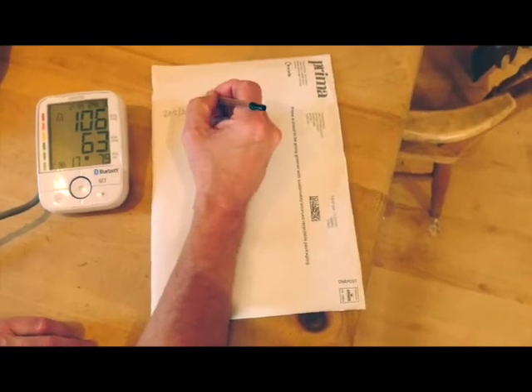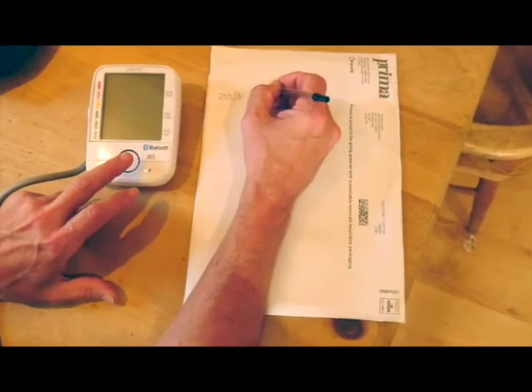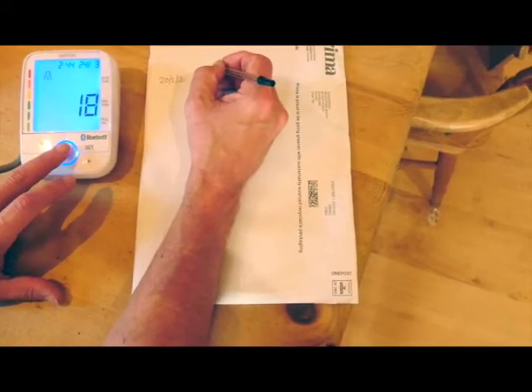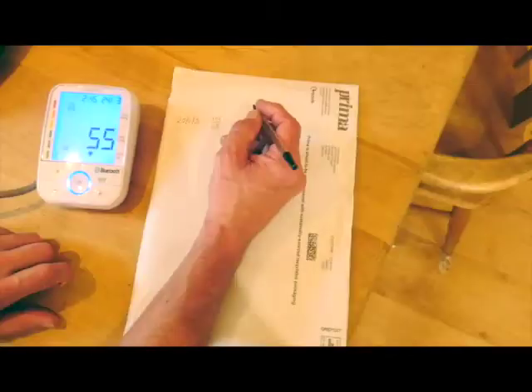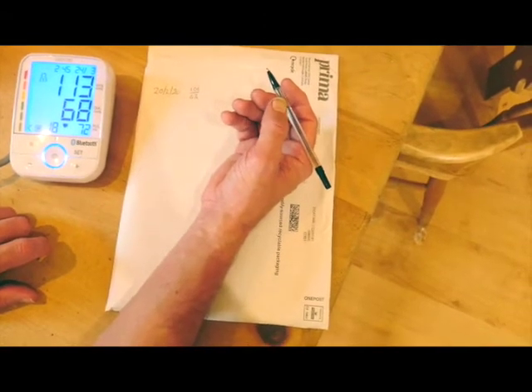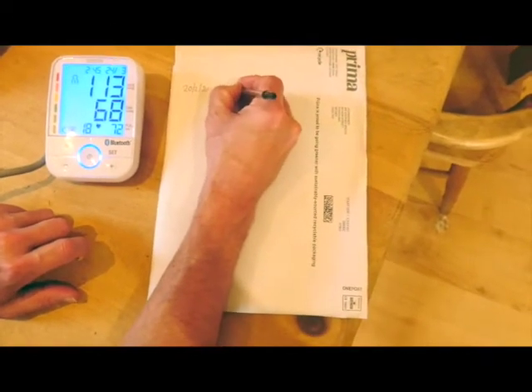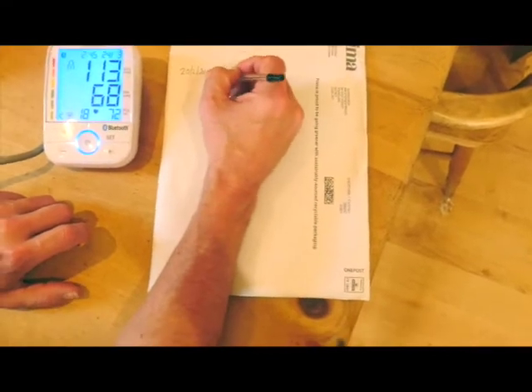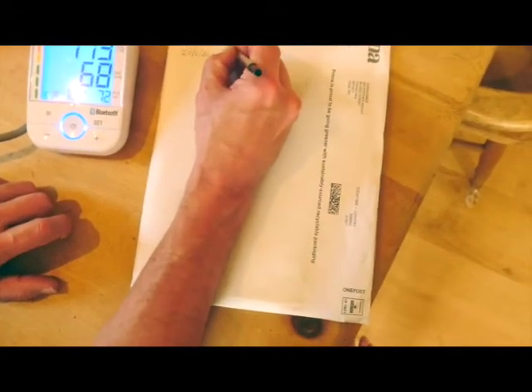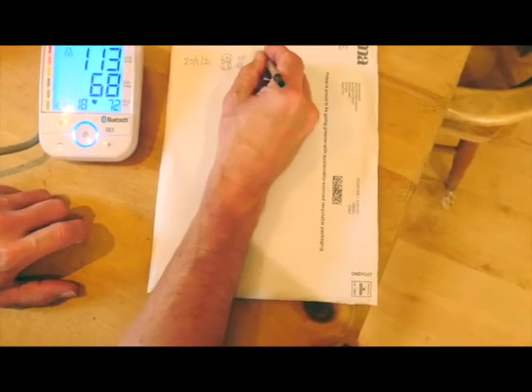And then what we do is do it again. You write down your next number — so you blow it up again. And then you write down your next number, so that one was 113 over 68. What you'll do is take maybe two, or if you're bothered, three readings in the morning, and pick the lowest systolic number — that'd be that one — and the lowest diastolic. That's the lower number for each session. So that's your morning.